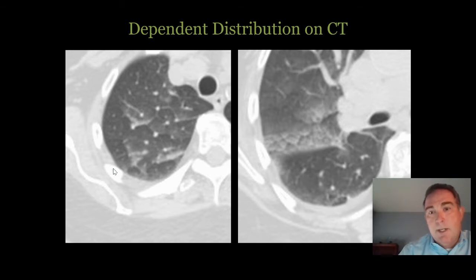This is edema on CT. It layers dependently in the secondary pulmonary lobule. So just something to keep an eye out for. Sometimes when we're reading CTs, when we see edema, it's a little distracting because we're just so used to seeing it on X-ray, but not on CT. But just keep that in mind, especially in our hospitalized patients who seem to get more and more CTs these days.